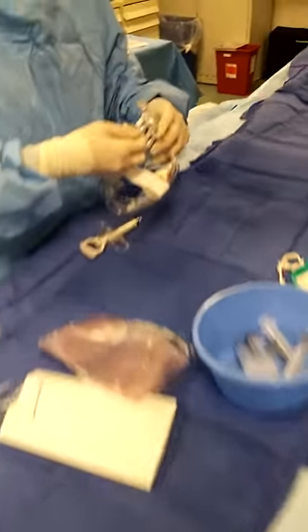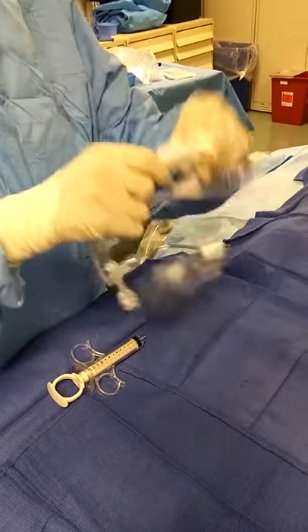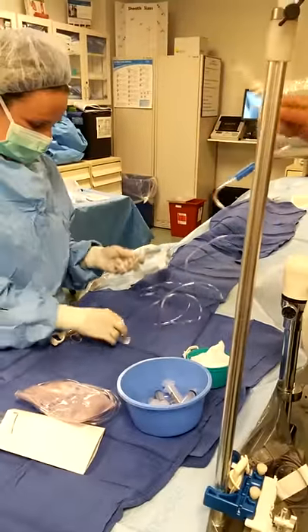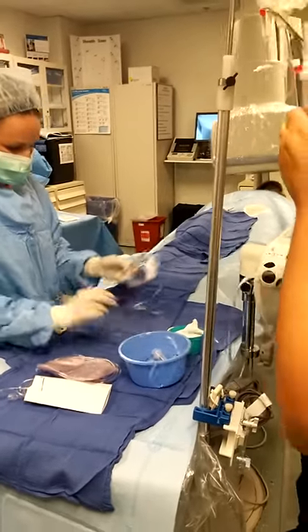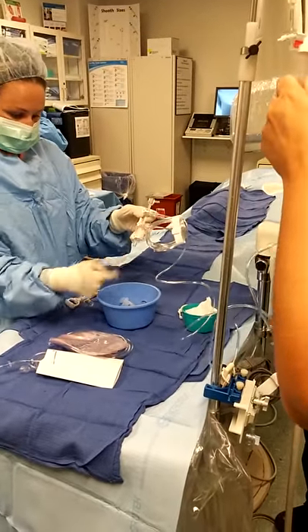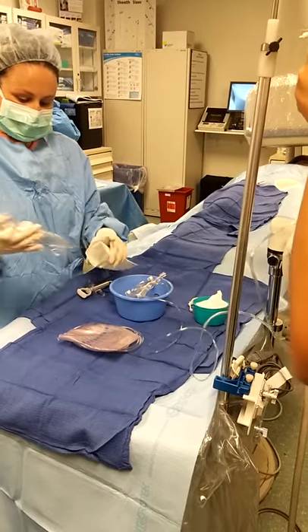I'm tightening my luer locks. Will you please put this in my heparinized saline bag? My flush line is handed off first.